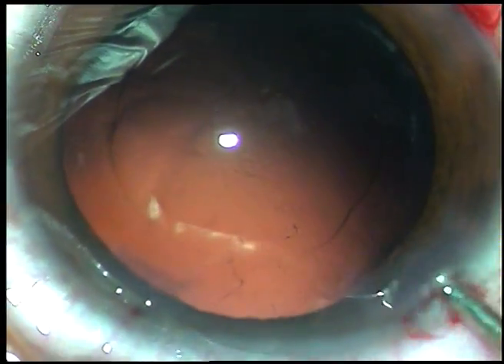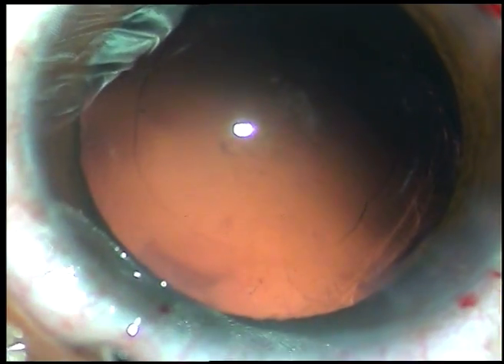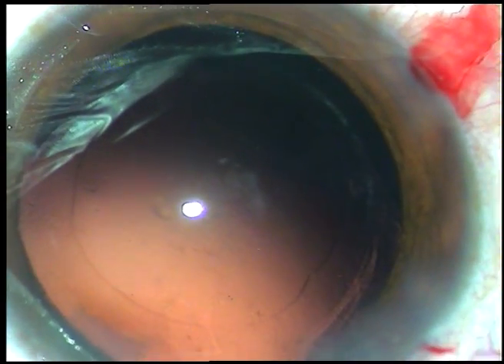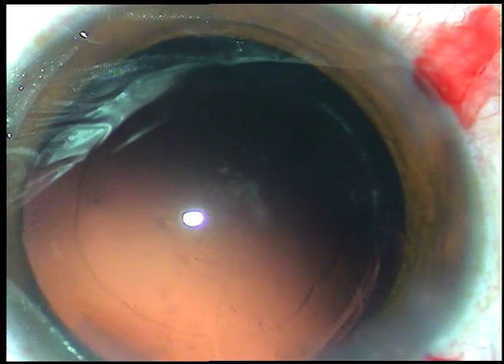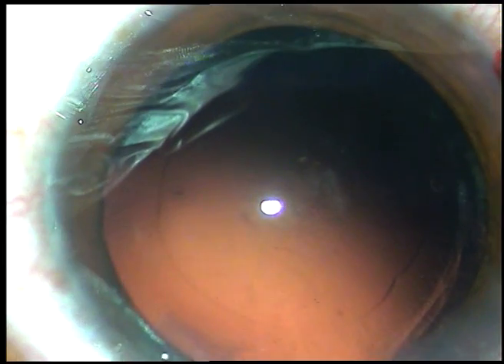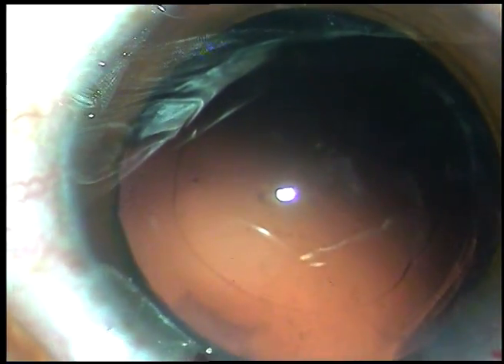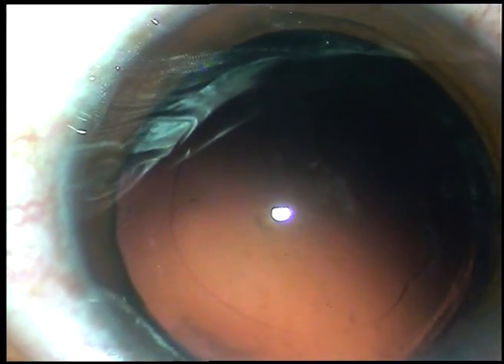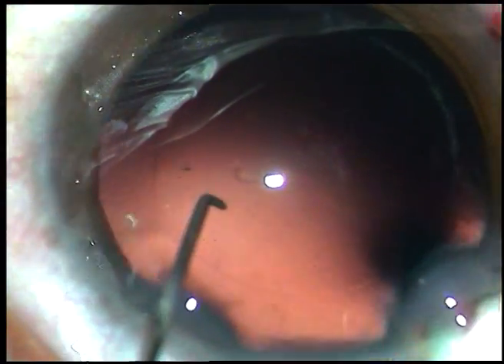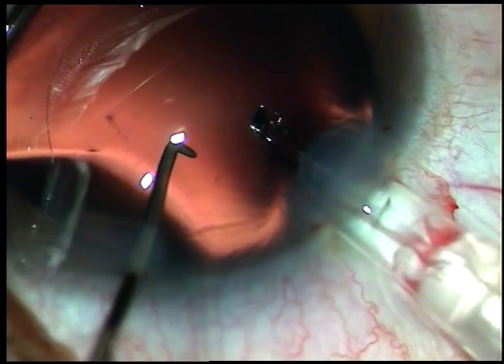But this plaque will not cause much hindrance to vision and I can wait about three months. Viscoelastic substance has been injected into the anterior chamber and into the capsular bag. Now, in this case, I am going to implant a hydrophobic acrylic aspheric intraocular lens from Abbott Medical Optics. No financial interest, but it is a far better lens than the Acrysof material.